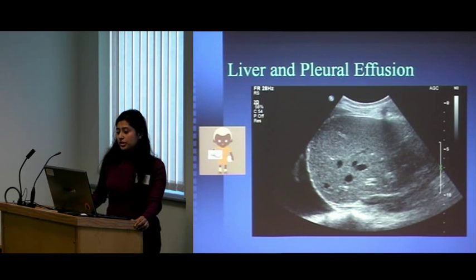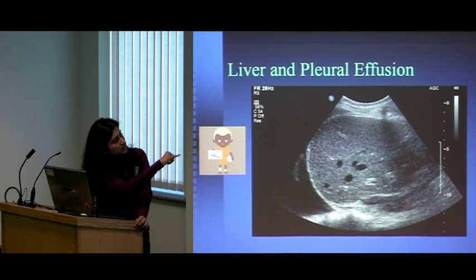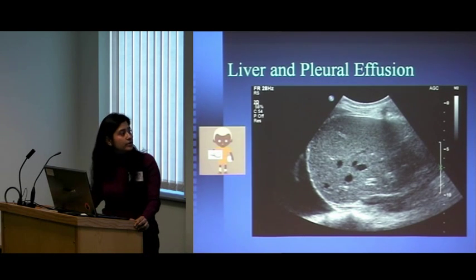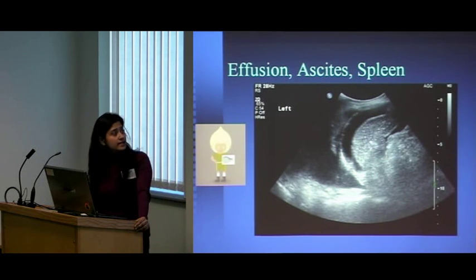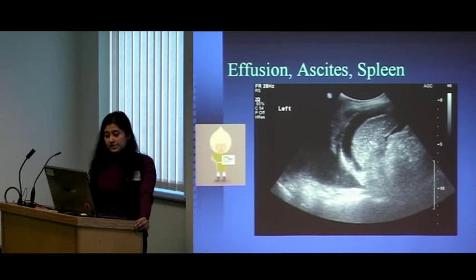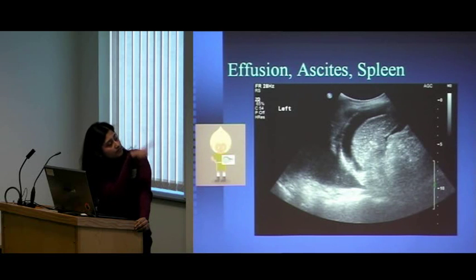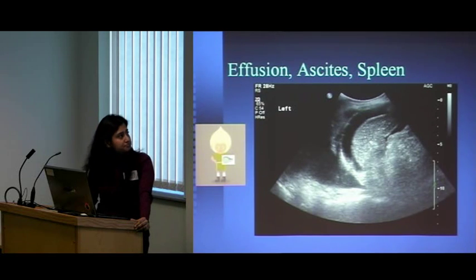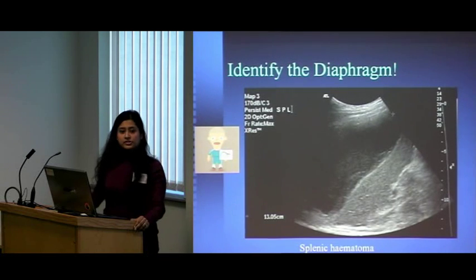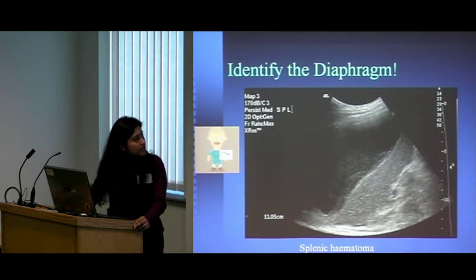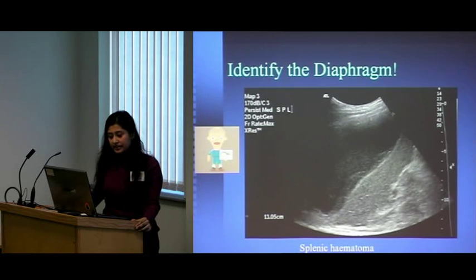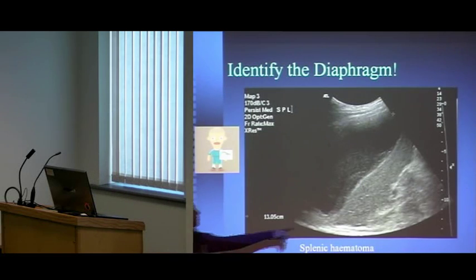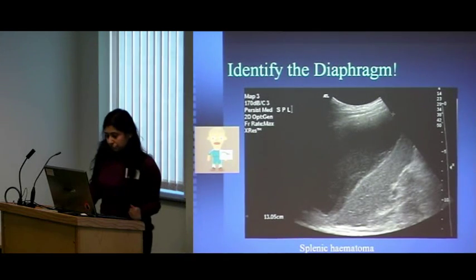Here are some examples of pathology. You can see the liver, the diaphragm at the bottom, and on the other side the pleural fluid, which is black or anechoic. One slide shows the difference between ascites and effusion — the spleen surrounded by dark ascites fluid, the diaphragm, and the pleural effusion on the other side. Another slide shows the importance of correctly identifying the diaphragm: what might be mistaken for the diaphragm is actually a splenic hematoma, where the darker part is a hematoma within the spleen.